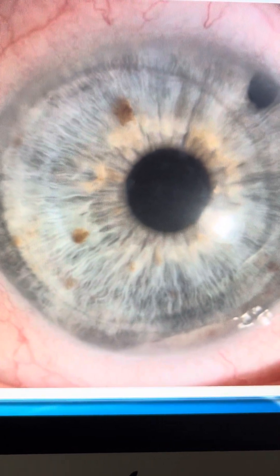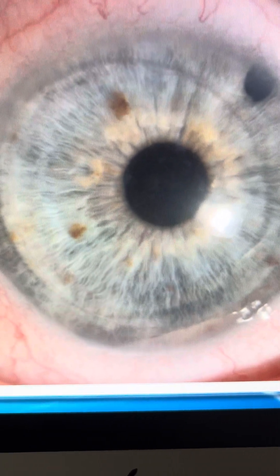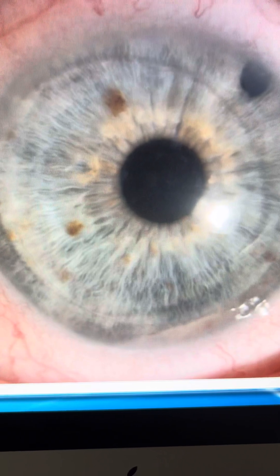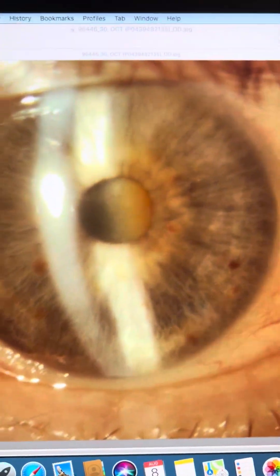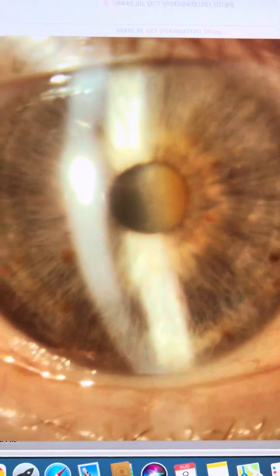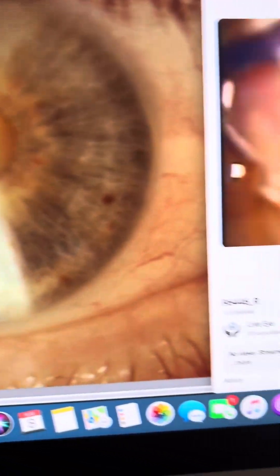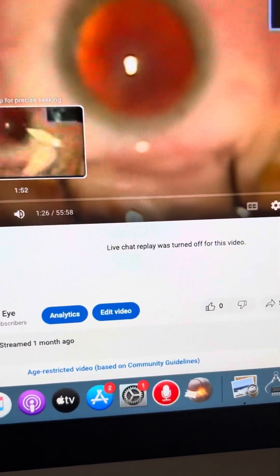This is a 76-year-old pediatrician that we were able to help by performing a repeat DSAEK endothelial keratoplasty and cataract surgery. She had a previous DSAEK surgery done elsewhere, and this is how we picked her up — with a very significant brown cataract and a failed graft. I will show you some highlights from the procedure.